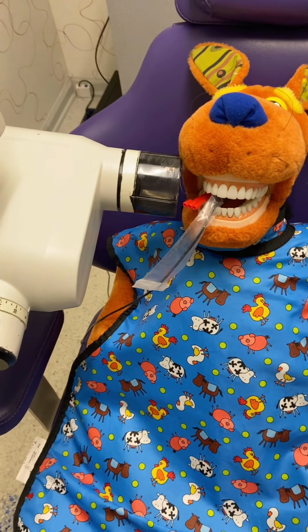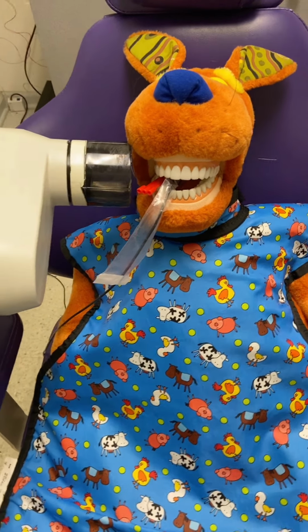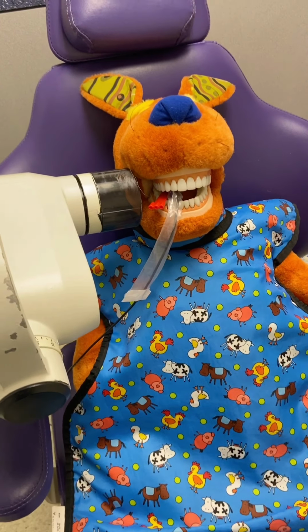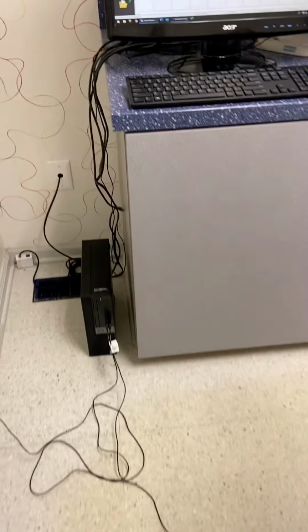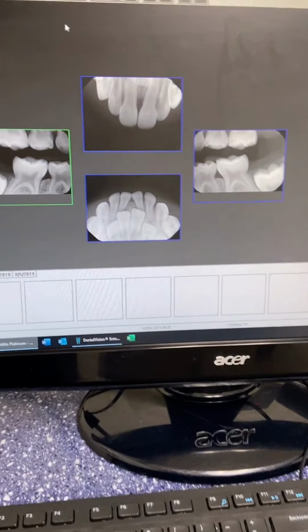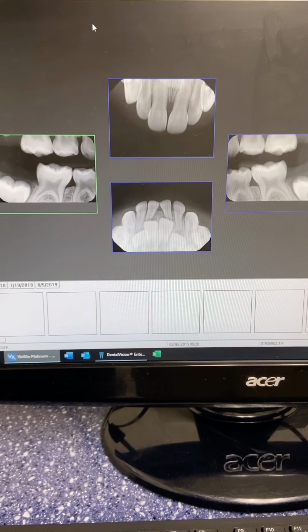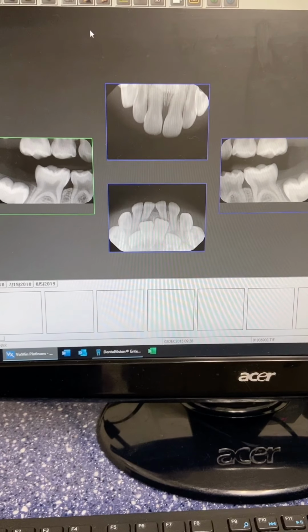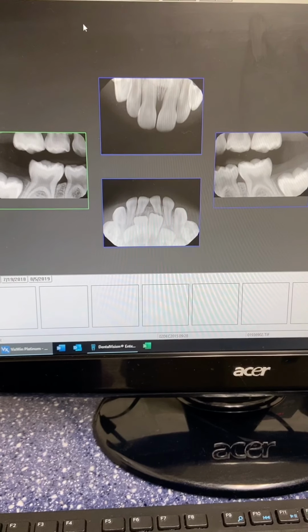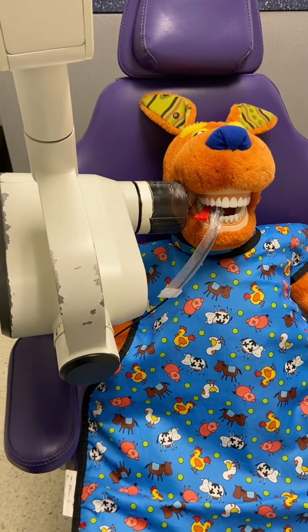The camera is the little circle part that's pointing right towards his teeth. But what we do is when we're normally taking pictures, we would take a couple of them, and I just wanted to show you what they look like normally when we would take them. So your first pictures would be like the front ones and top ones, bottom ones, and the sides. They help us see around between your teeth and they help us make sure that everything is strong and healthy. So that's what it would be like if you actually came in to have some x-ray pictures taken of your teeth.